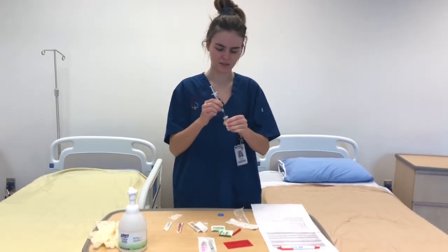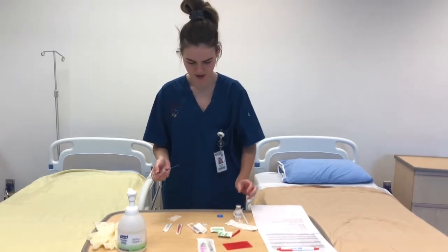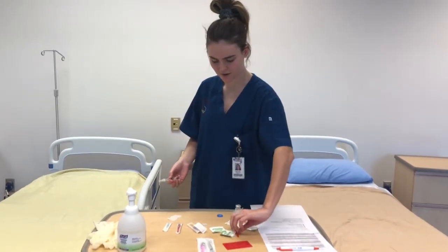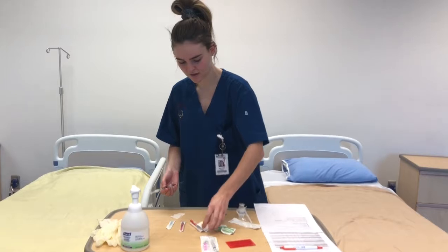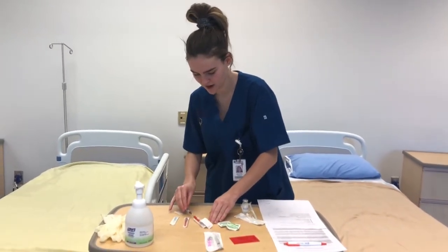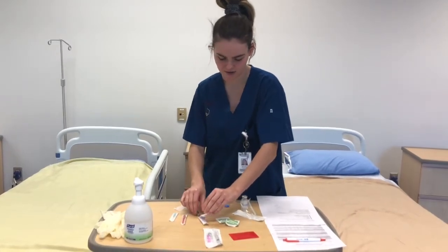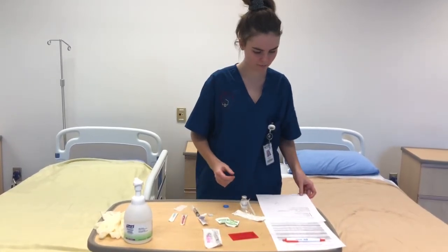So the 1 milliliter has been drawn into the syringe, and I'm going to recap it now. So carefully, without touching it, I'm going to insert it into the cap and push so that it is recapped.